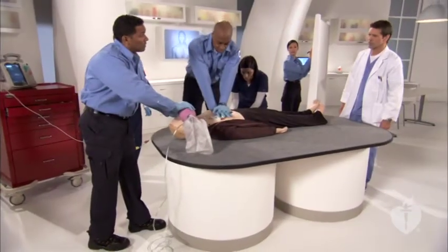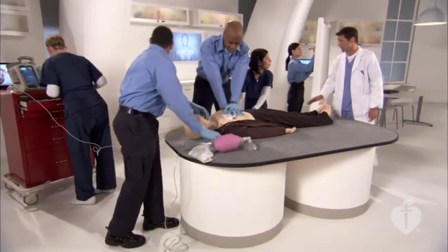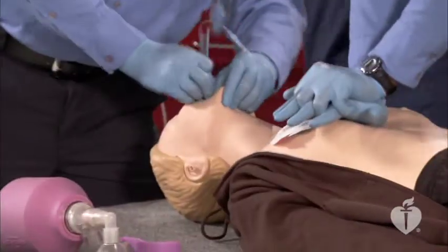Welcome to the American Heart Association's Airway Management video. Airway management is one of the key interventions in the BLS and ACLS surveys. How you manage the airway depends on your training, abilities, and scope of practice.